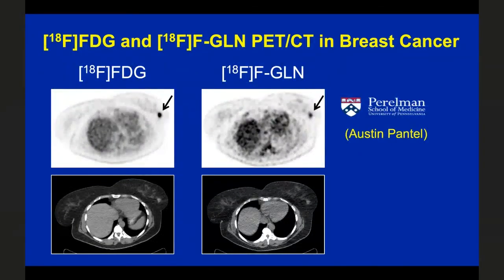Those tumors that were less aggressive and weren't burning glutamine would actually have higher pool sizes and show up better on these scans. And in fact, some of this has been seen in some of the early work. So in general, when we interpret these studies, because of the nature of the glutamine signal, we're always going to need to interpret that in the context of another signal, and in particular, a direct comparison of glutamine to FDG, in this case glutaminolysis to glycolysis, shows us what we're looking for, and that is in particular that relative to some mean, glutamine turns out rather faint compared to FDG, this one being somewhere in the middle around that mean.